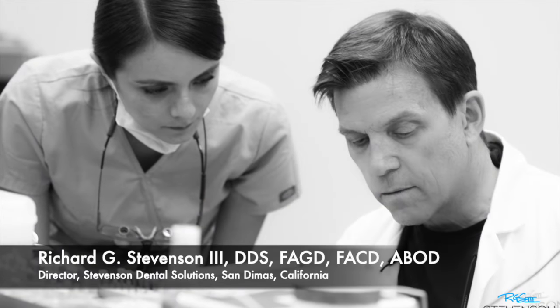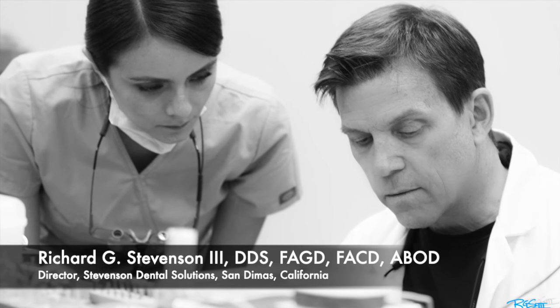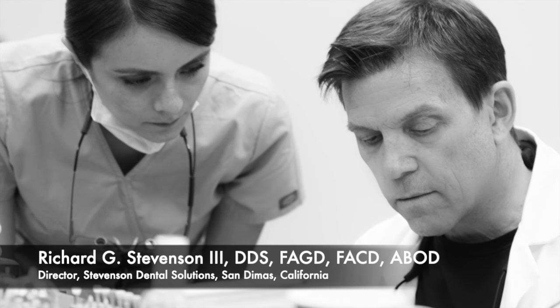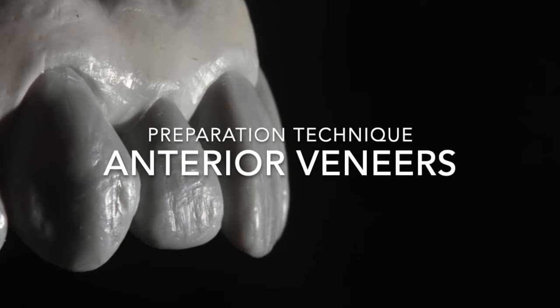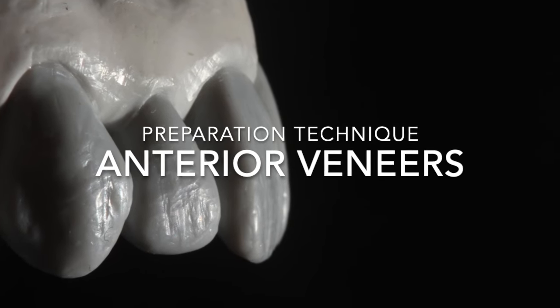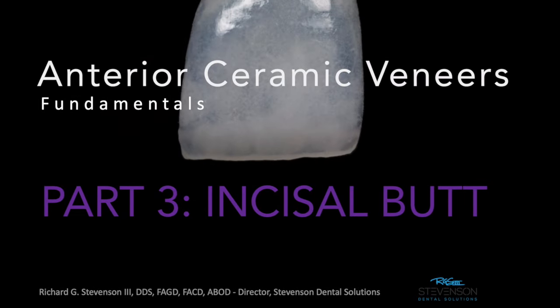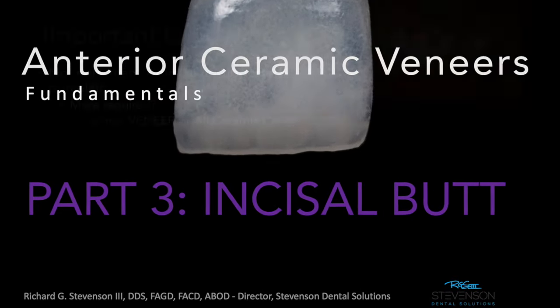Hi everybody, I'm Dr. Richard Stevenson and I'm the director of Stevenson Dental Solutions in San Dimas, California. Today we're going to be continuing our series on veneer fundamentals and we're going to be discussing the incisal butt veneer. This is a six-part series and it's recommended that you watch the series in sequence in order to get the most out of it. We're going to put our attention today towards the incisal butt veneer, but let me go back and review some important guidelines.